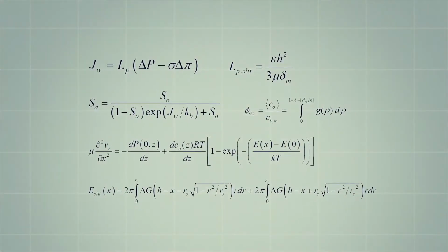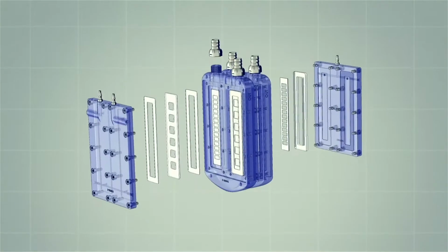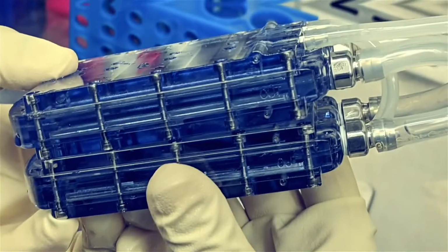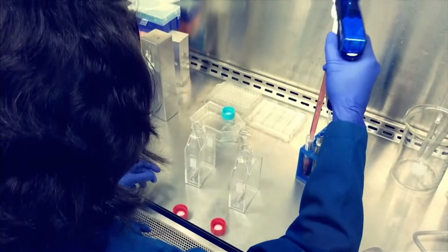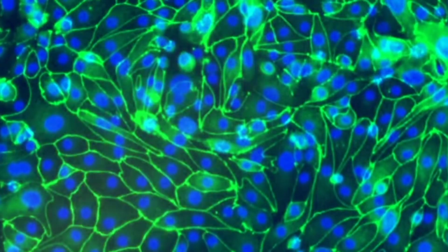After a decade of engineering development to refine the hemofilter and bioreactor components, preclinical prototypes of the implantable bioartificial kidney have been successfully created. Clean room microfabrication processes have been established to reliably produce high-quality silicon membranes. Tissue culture protocols have also been optimized to reproducibly grow renal tubule cells and maintain their function.